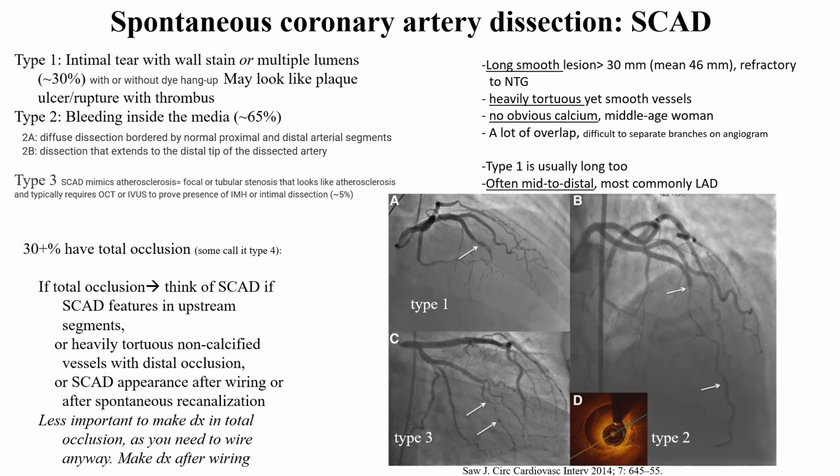Yes, it's very important to make a SCAD diagnosis, because if it is a SCAD, you can just wire it and balloon it, reestablish flow. You do not need to stent it. Also, SCAD has a very different long-term prognosis. With a SCAD, it will heal, and you may want to document healing with CT imaging at 6 weeks.